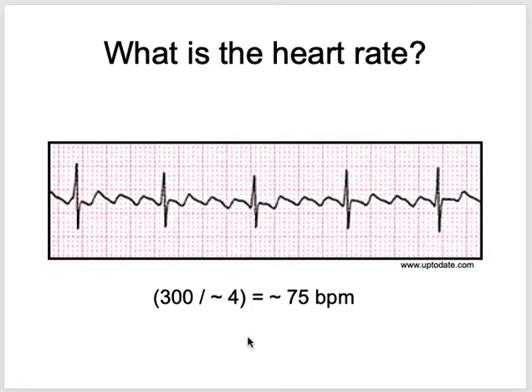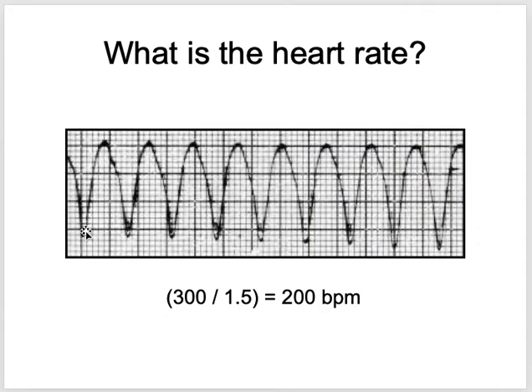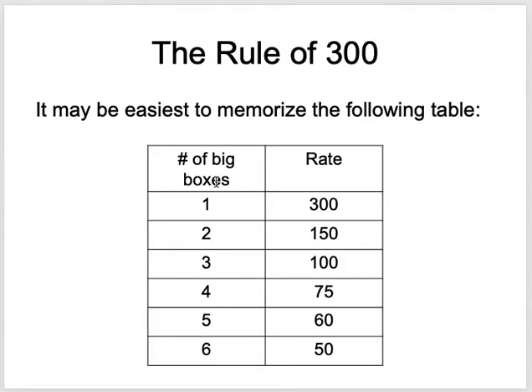So now, the important thing over here is what? Nowadays, the ECG machines are more sophisticated. They write down the heart rate above the ECG. Now one problem is that the heart rate is not always regular. In this one, see this one and this one and this one, the spacing is equal. So it means the heart rate is regular. If you take something and measure this one and this one and this one, all of them are at the same distance. So the heart rate is regular, right? Sometimes the heart rate is not regular. This is the rule of 300.